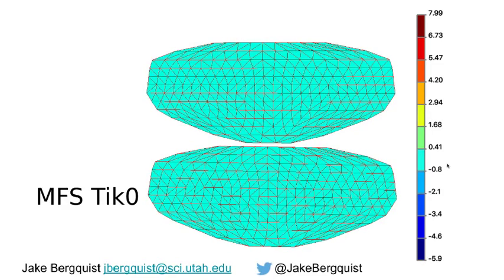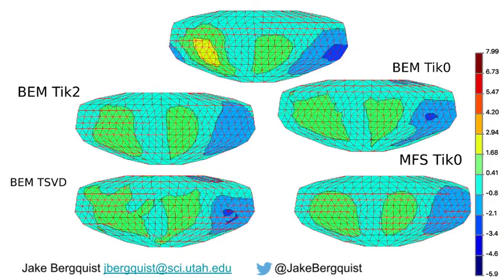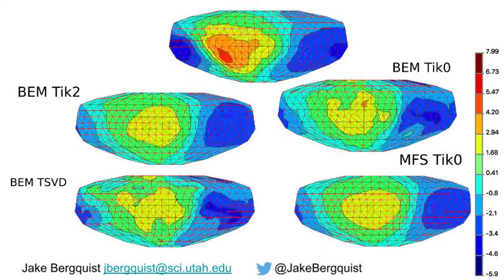And finally is method of fundamental solutions with Tikhonov's zero order. Now let's look at all four inverse reconstructions as compared to the measured. Let's stop the beat in the middle of the QRS, just about there.